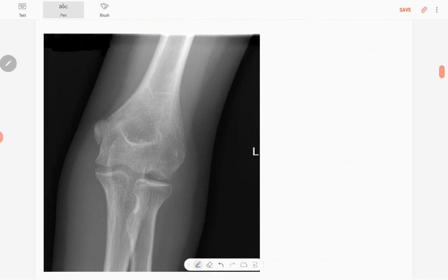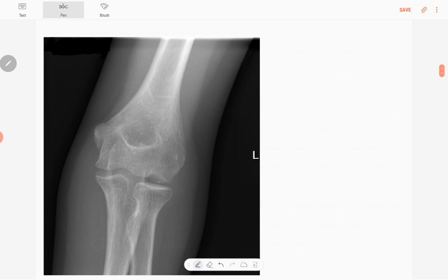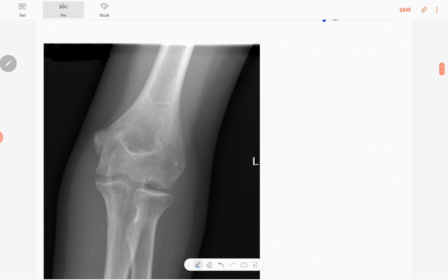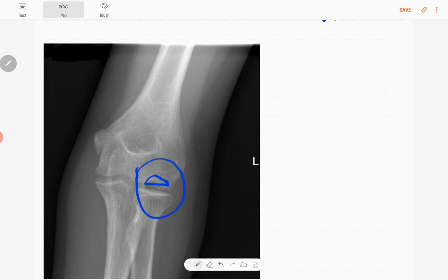This is the anteroposterior radiograph of the left elbow joint. The abnormality is around this region here — there is a lucency in the capitulum of the distal humerus. It does not have sclerotic margins and it has a narrow zone of transition.